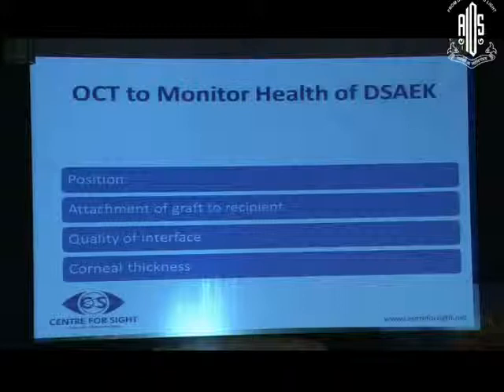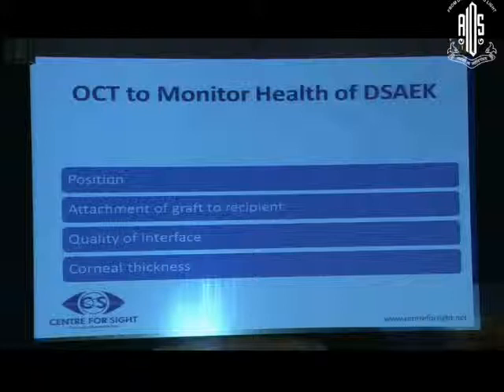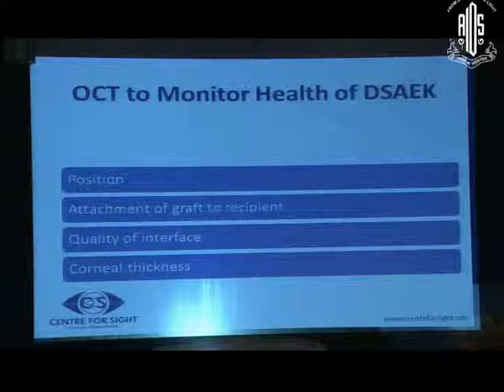OCT has also become a very important tool for corneal surgeons as it helps to monitor the health of the DSEK graft. It provides information regarding the position of the graft, attachment of the graft to the recipient, quality of the interface, and corneal thickness.